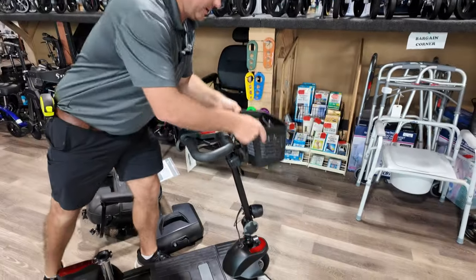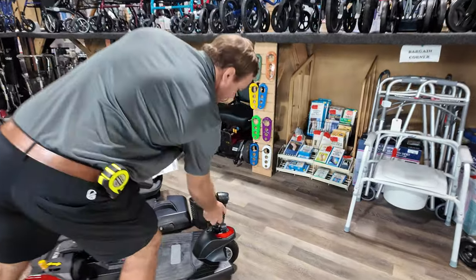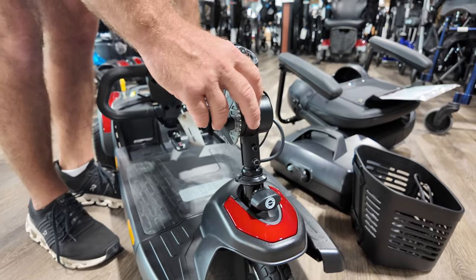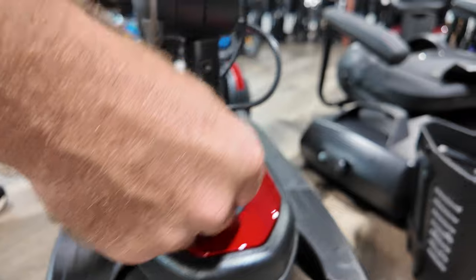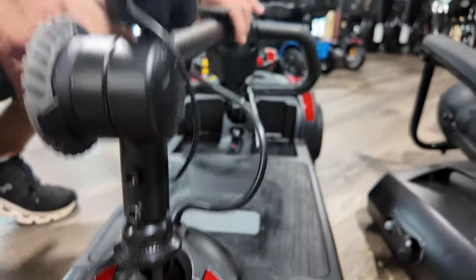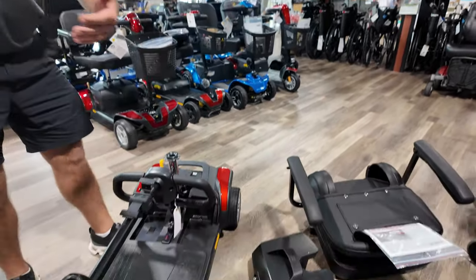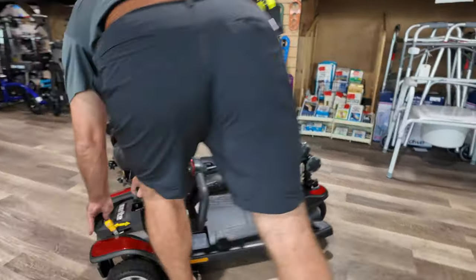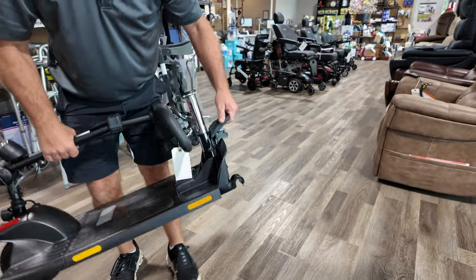To fold this up or disassemble it: take the basket off, turn this knob — make sure you get it loose enough so you don't grind on this — then tighten it back up. This is going to move on you, so press it in and turn it; this allows it to stay and not move as much. You can pick the whole thing up, or if you need to reduce the weight you would disconnect it just like you would on a Go-Go or a Golden.